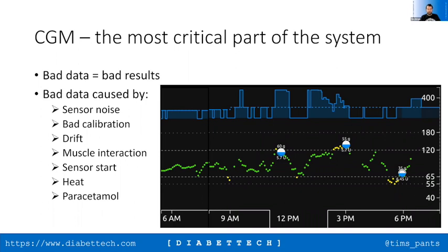I know, having spoken to consultants associated with it, that they were very close to raising an issue with the MHRA about it. So we do have to be aware that there are potential issues in using DIY systems to convert a non-CGM system to a CGM system. If you don't calibrate it safely, you can put yourself in a very dangerous position, and it has happened. So just want to make that very clear at this stage.